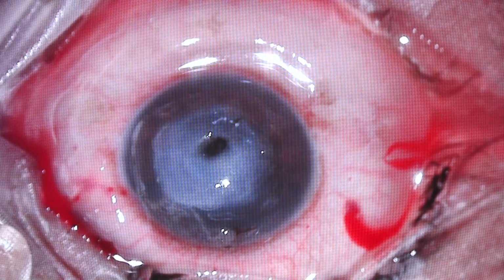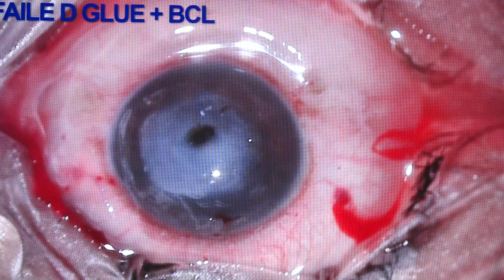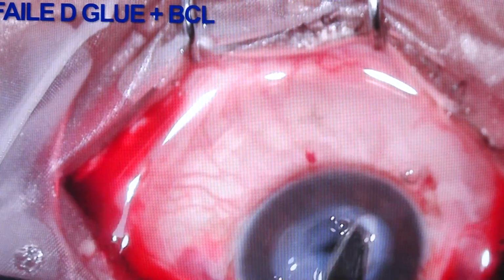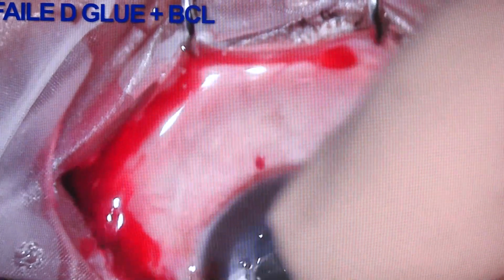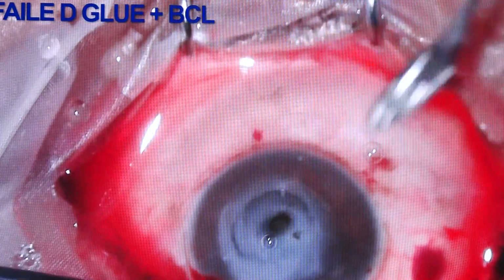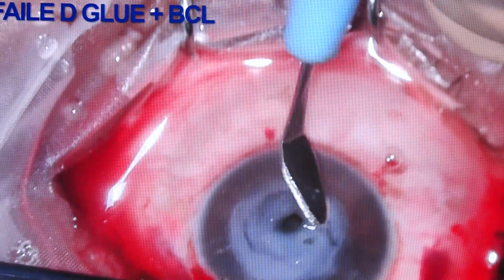This is another case of a failed glue BCL done by me only. The patient came with a flat AC after 3 weeks. Earlier there was a central thinning, but now the adjacent tissue had also thinned out quite a bit. Now this patient was on warfarin, and we could not plan a keratoplasty for her. She was not given clearance for a surgery.